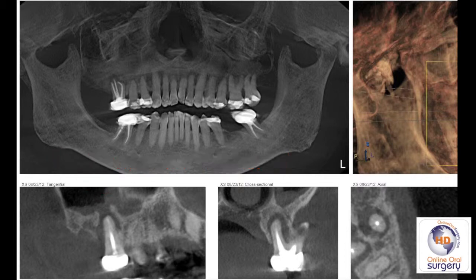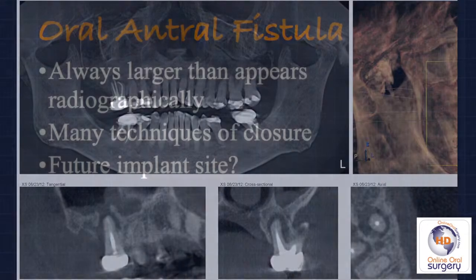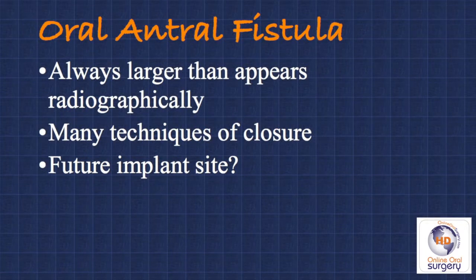There's going to be lots of granulation tissue in the apical region of this tooth, and once you curete that out you're going to have a fairly large opening into the maxillary sinus. One thing that many years of clinical surgical experience teaches you is that when you go in to deal with one of these lesions, they are always much larger clinically than they appear radiographically.